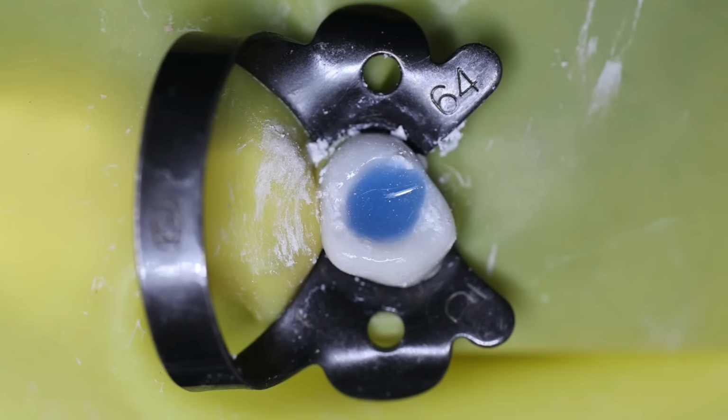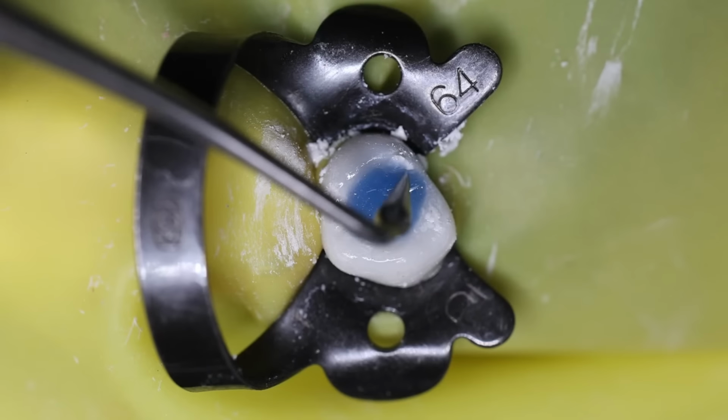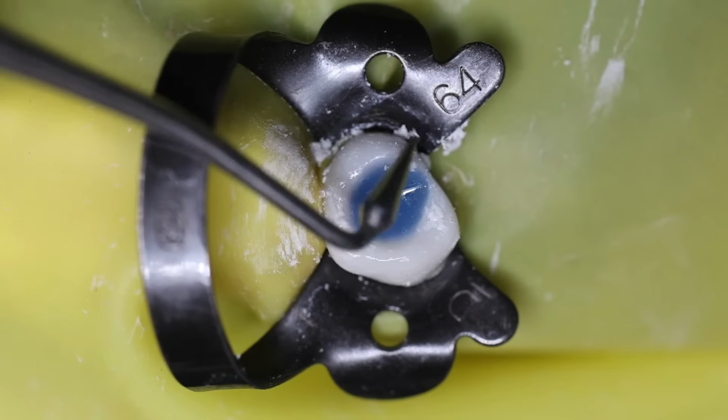So the third increment is done, and you can check whether the composite is set. Yes, it is set completely and within the contours.